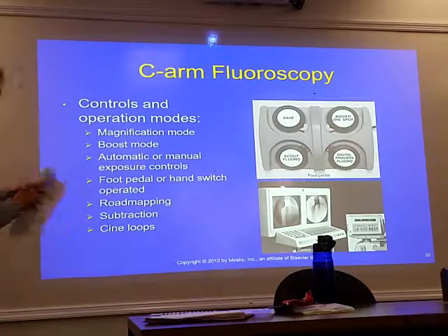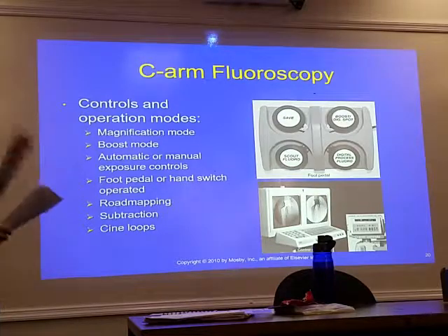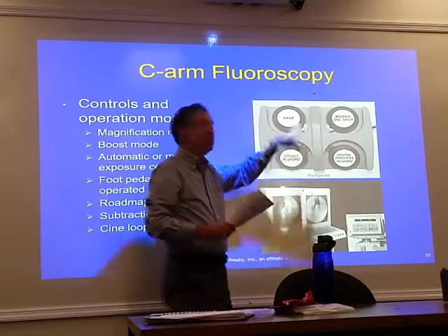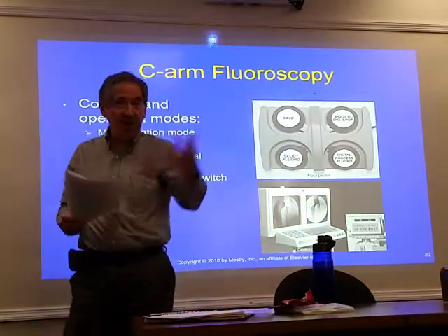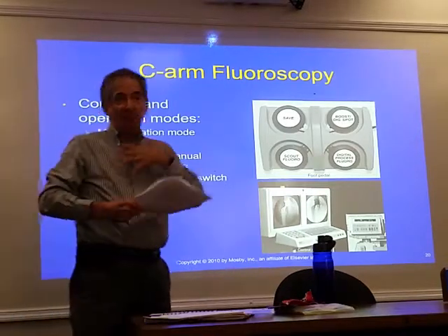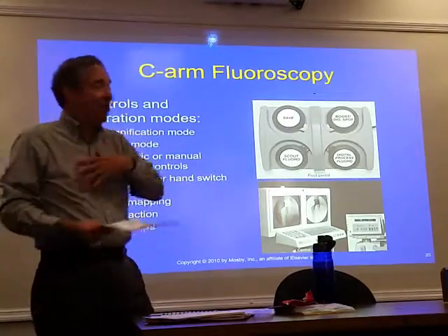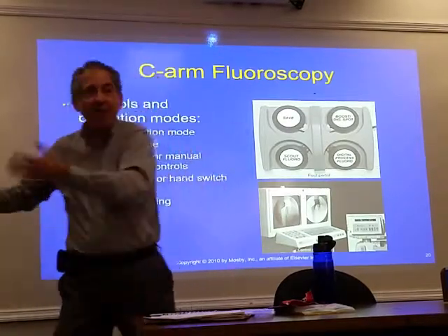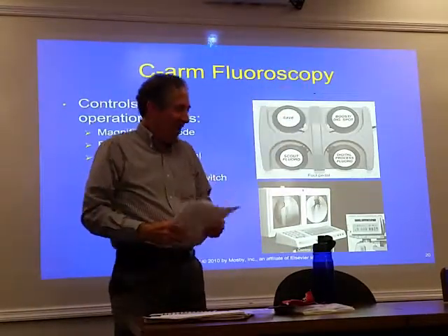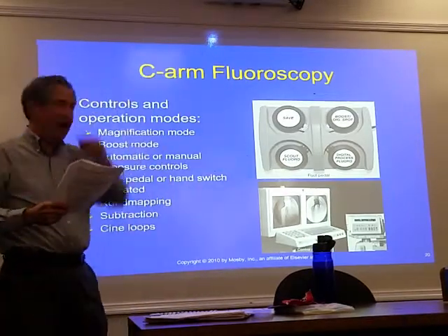Let's talk about some of these in here, and I talked with Bob, and Bob, thank you again for the information on this. You've got your foot pedal here, and what's nice, Bob was saying, is that in a lot of places the doctors use the foot pedal, and that's really best. Otherwise, the responsibility is on you, and they'll be asking you to start the fluoro. Again, they'll use terms like, with me, they would say "flame on," which sounded like a cartoon thing, or "X-ray," or whatever. And so it'd be your responsibility to activate that.